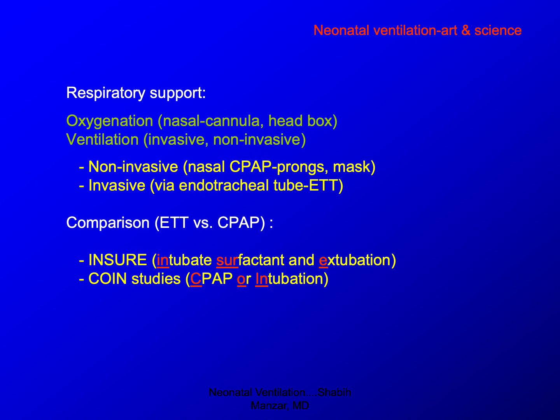These are certain studies which have been done to show that non-invasive ventilation is as good as invasive ventilation. Earlier, like 30-40 years back, there was a time when the tube was left in situ for a prolonged time, and people noticed a lot of complications, especially subglottic stenosis. And then since the advent of this concept of intubating, providing surfactant and extubating, the outcome has really changed. And of course, the ventilation strategies.